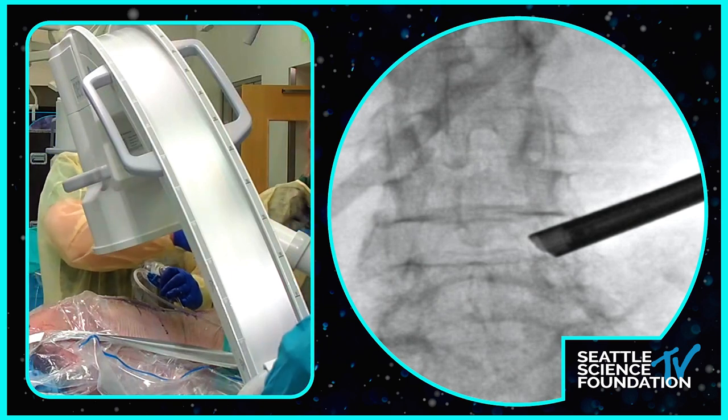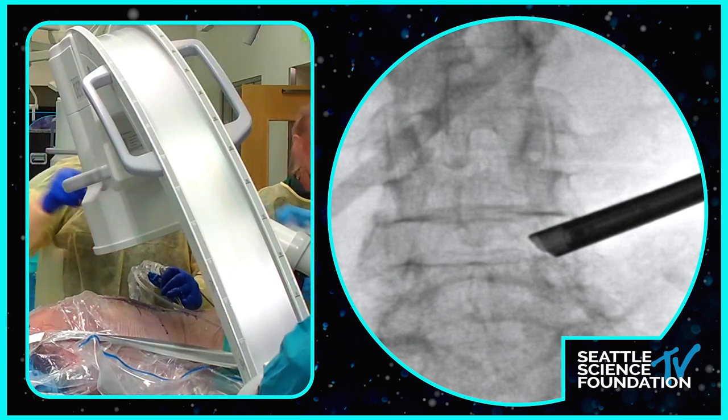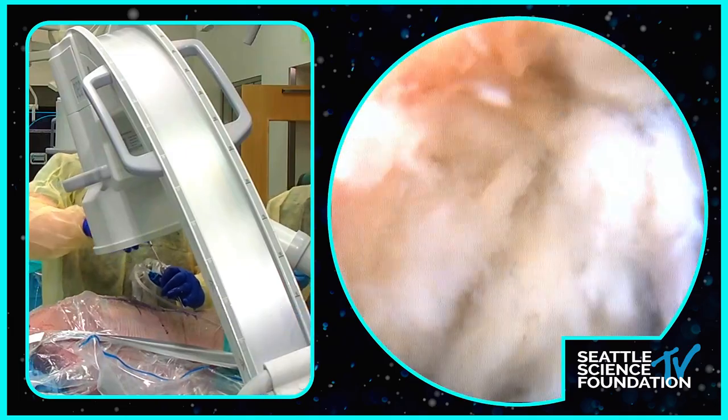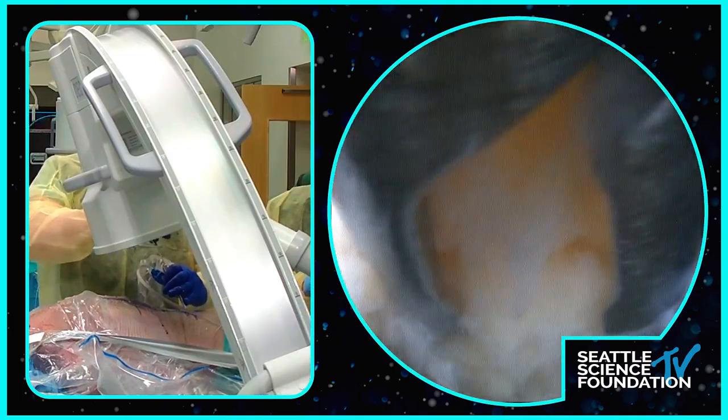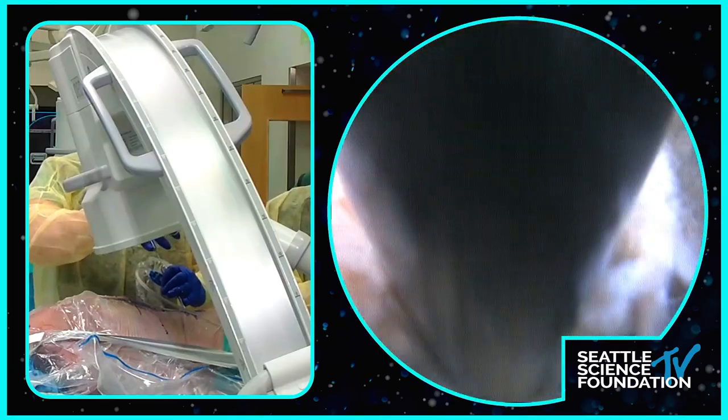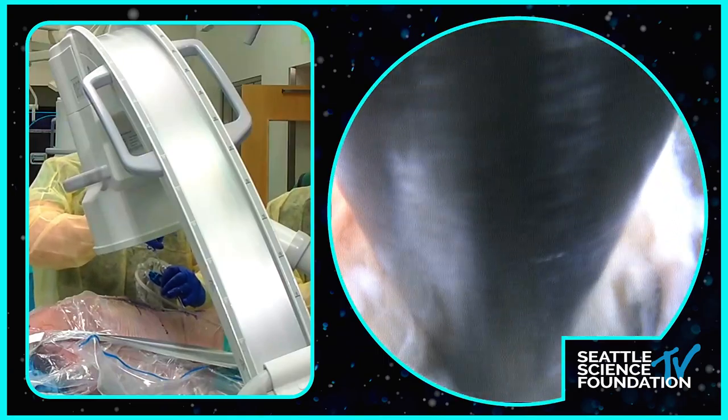Large grasper. So now we kind of have our hole in the disc and our trajectory. Hey, Ben, can we see the endoscopic picture? You can see I'm just digging in the disc here. And this is a big, tall disc, which makes this a little more difficult because there's a lot of space here.